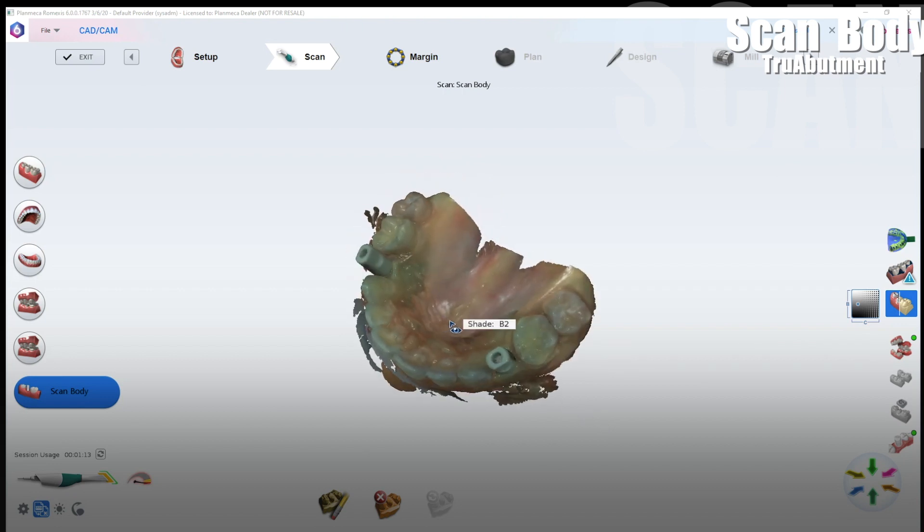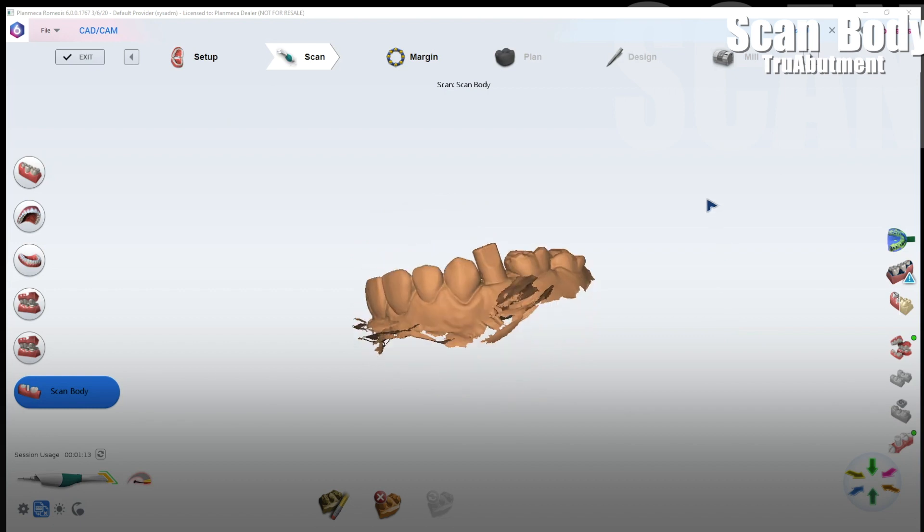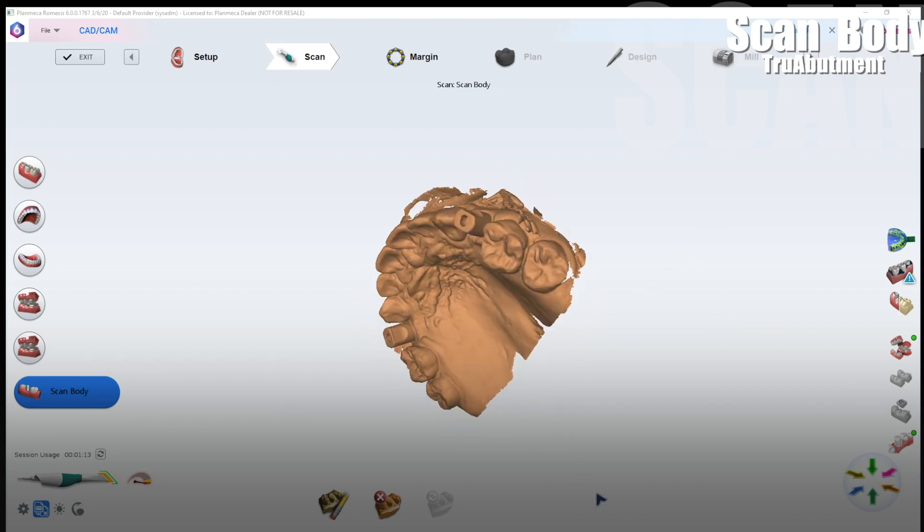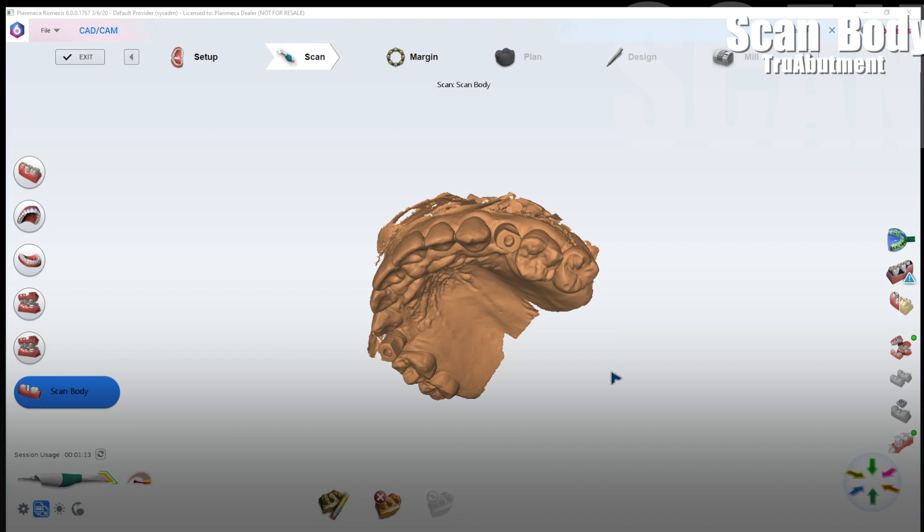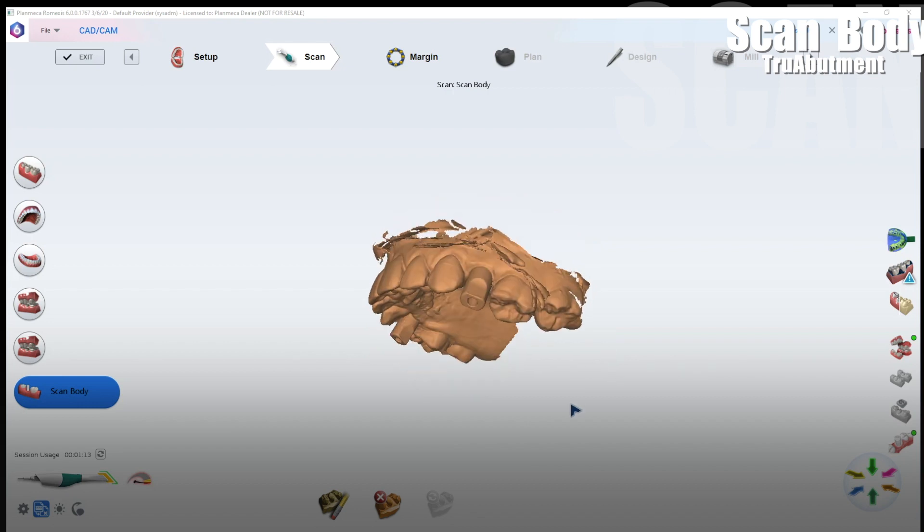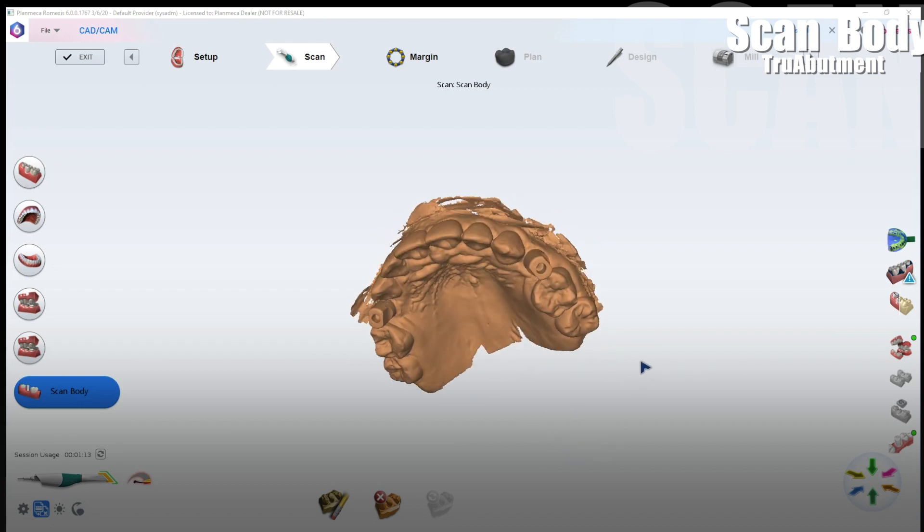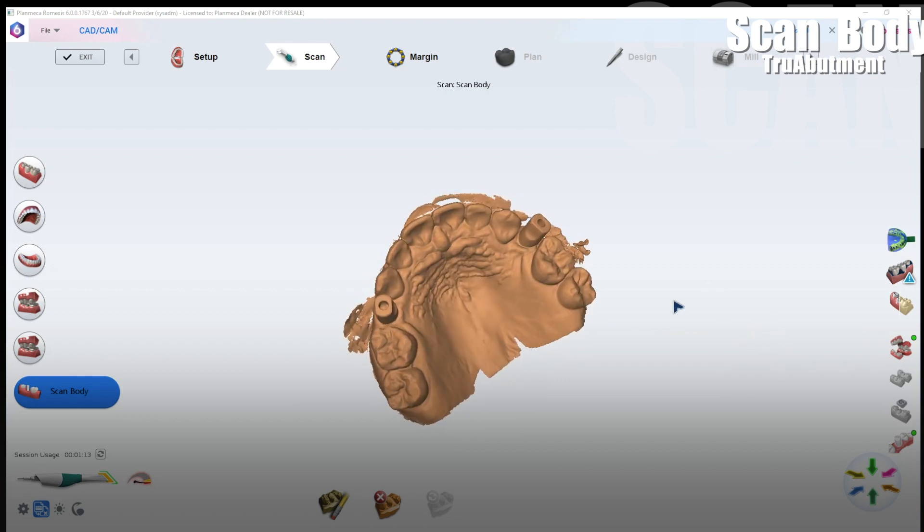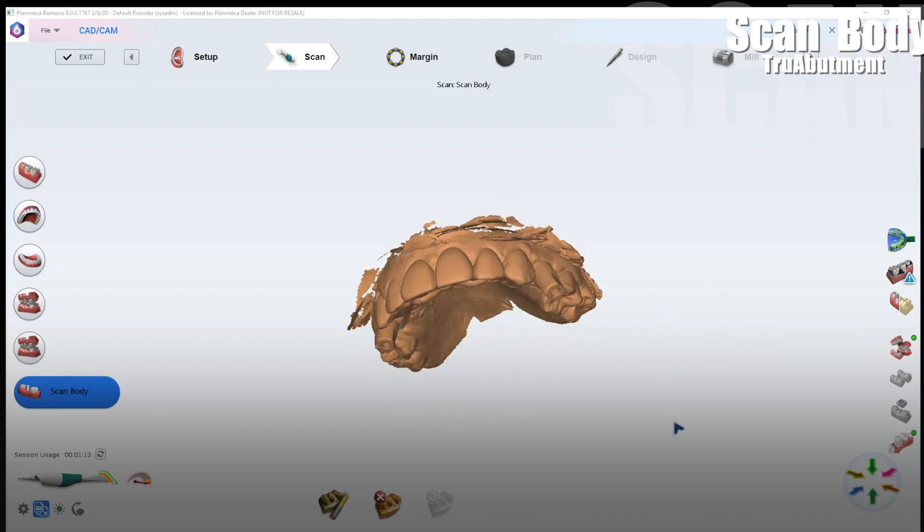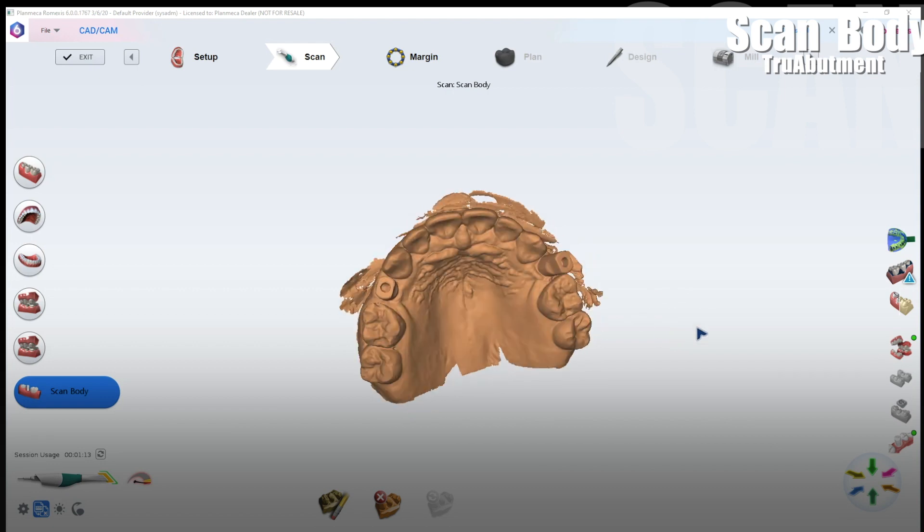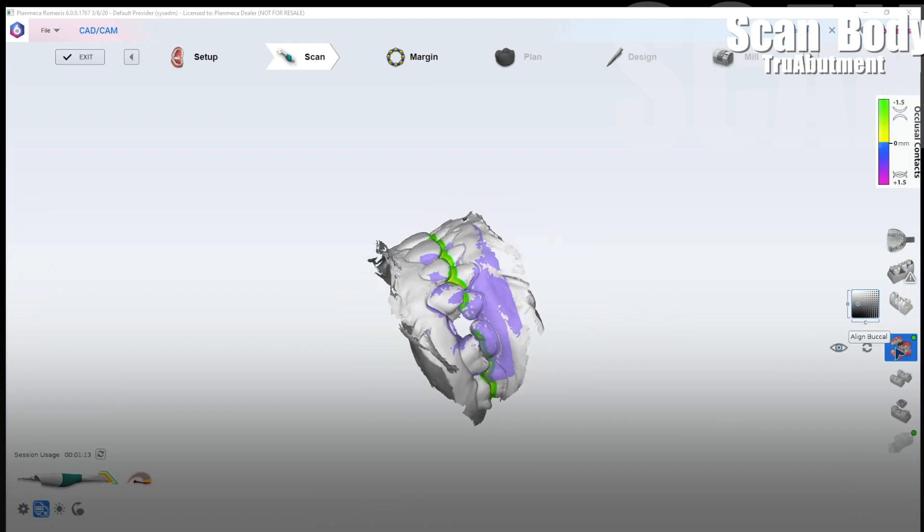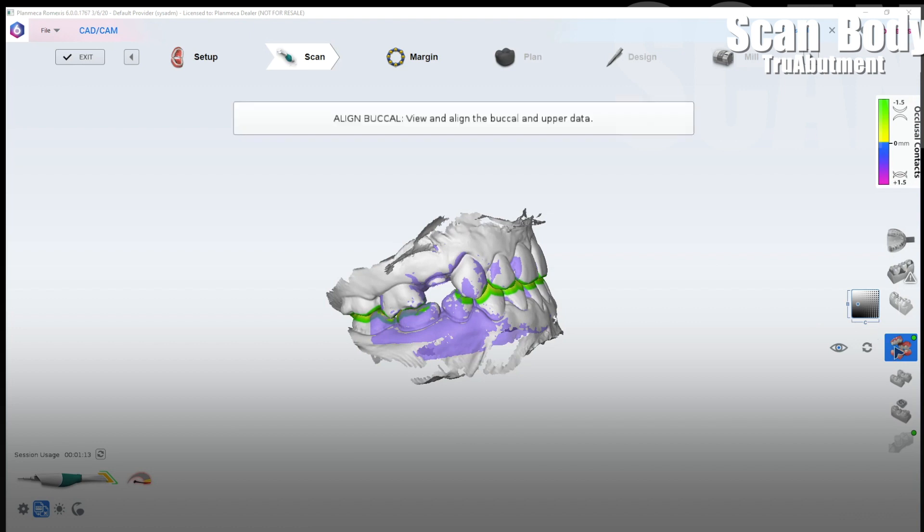That's everything that we need for this case to be able to send off. Let's turn off the soft tissue view, the color view and look at the raw STL view render of the stone model. Oftentimes the color could hide a multitude of sins and so I always look at the digital impressions in this stone view as well to make sure that everything looks crisp and clean. That looks pretty good and I think we're ready to send to the laboratory our bites articulated properly.